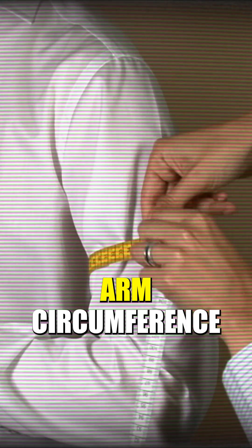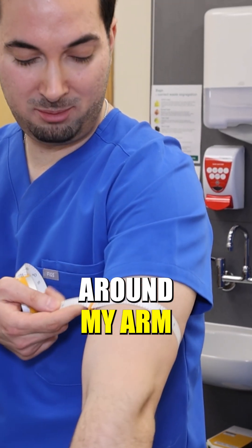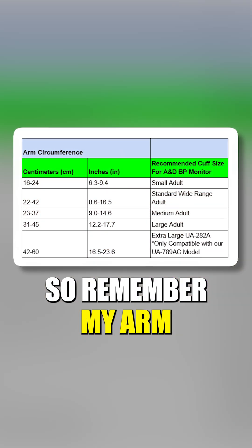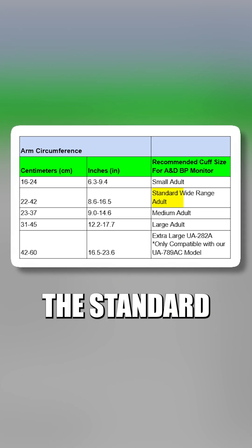we're going to get our arm circumference. I'm going to wrap the tape around — this is my midpoint that I've already calculated — and I'm wrapping it around my arm. My arm is about 12 and a half inches.